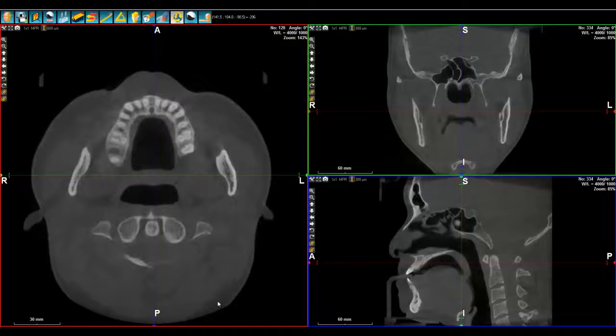One of the nice functions on WhiteFox imaging is volume calculation. Basically, if you are able to isolate any type of window or range of Hounsfield units, you can then display it in 3D, and you can ask the software to calculate the volume for you.